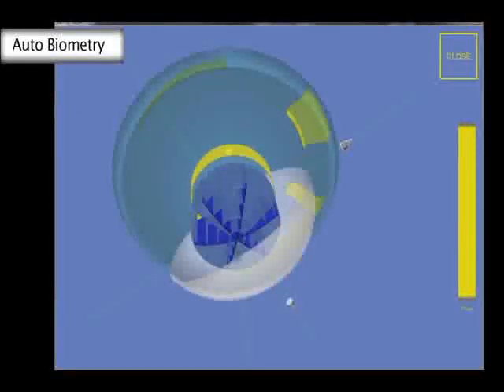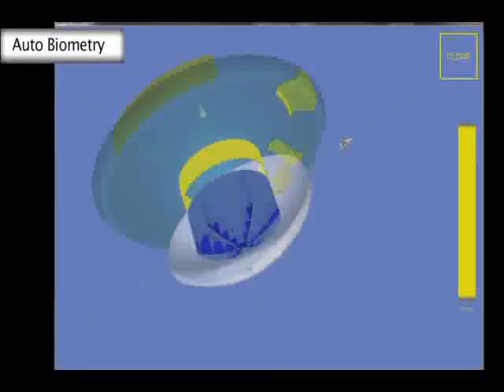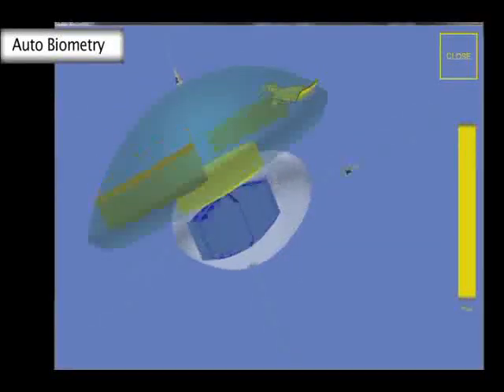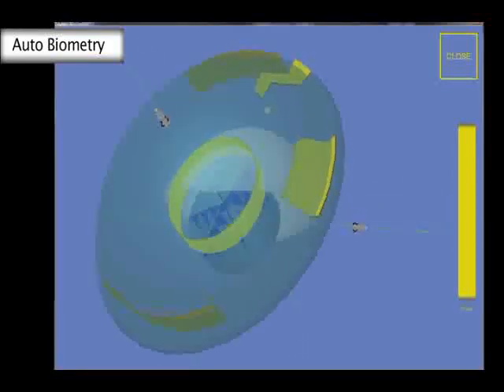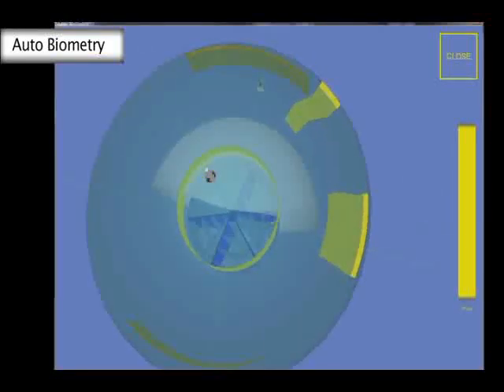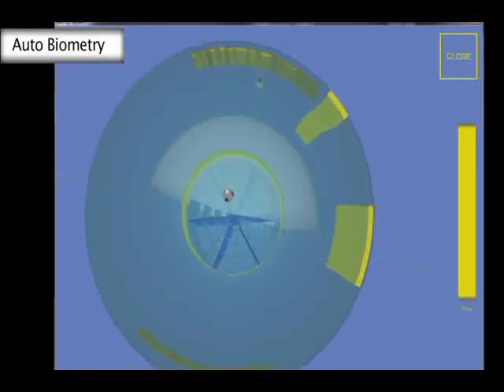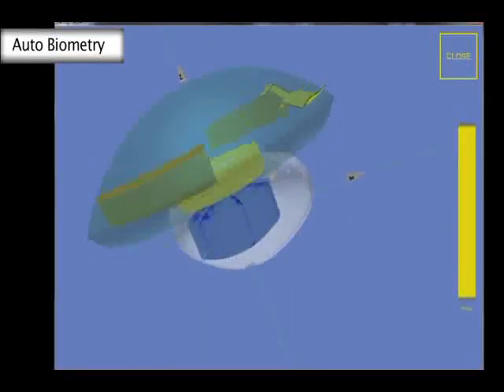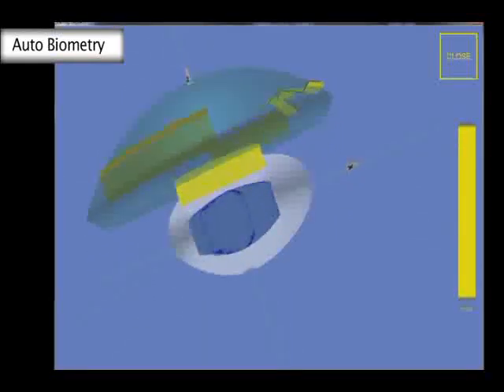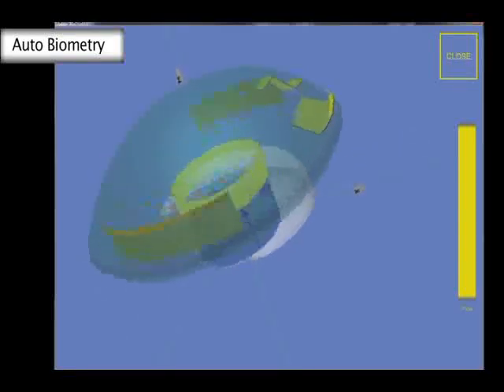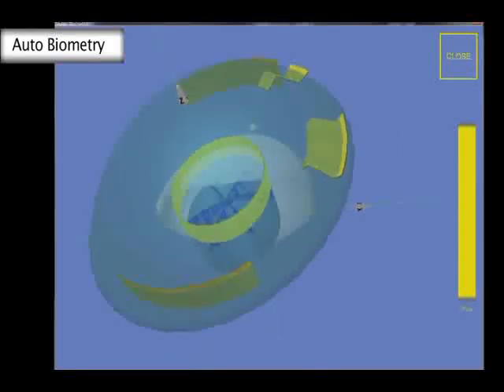Finally, the chosen treatment options are shown on the 3D model for final review prior to loading the pattern and starting treatment. Since most of the data are pre-loaded according to individual surgeon preferences, there is little input and change required between imaging and starting the procedure. The surgeon can review settings and start the treatment immediately.